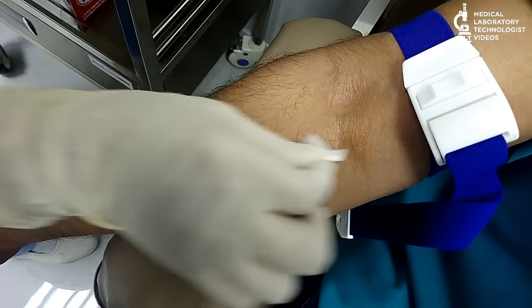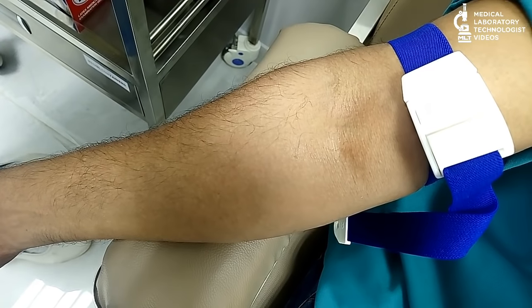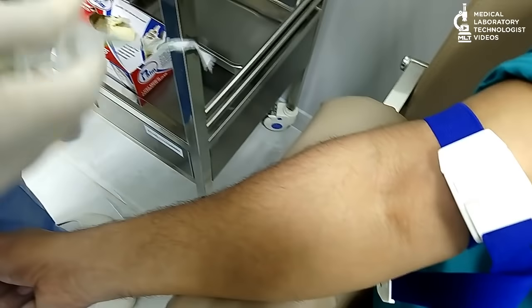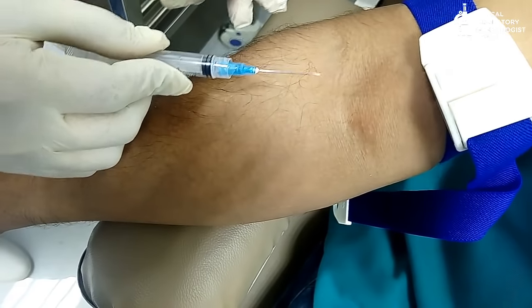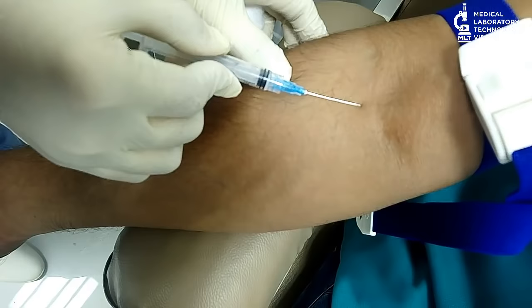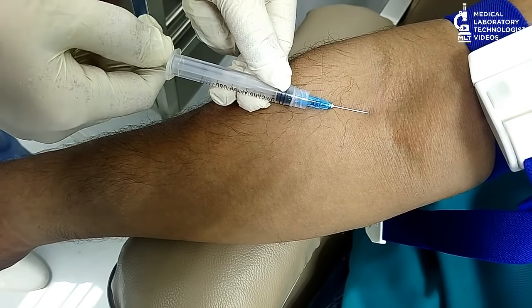Once you clean the area, do not touch it, because after that it will become unsterile. Then, open the syringe and insert the needle into the vein.